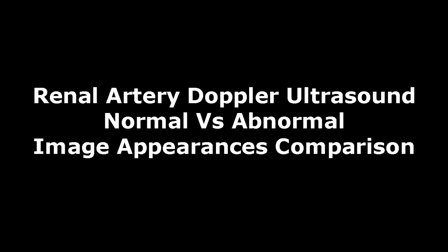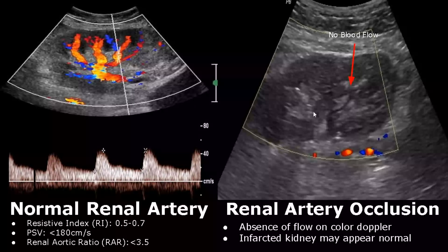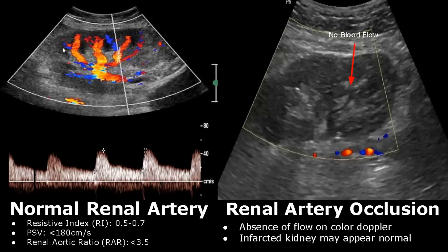Hello everyone, this is Dr. Sam and this video is about Renal Artery Doppler Ultrasound. By applying color Doppler while scanning the kidney, we can find the renal artery and its branches. The reddish color means blood flow is towards the probe, so blood is flowing towards the kidney, which means it is the renal artery.